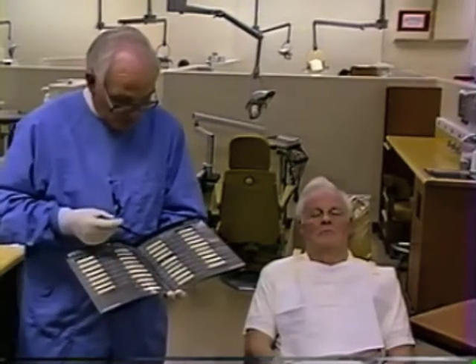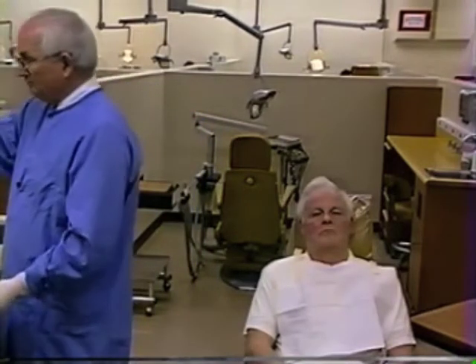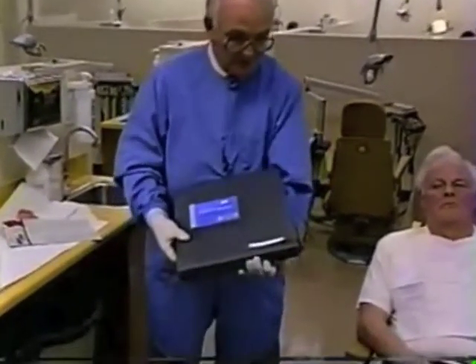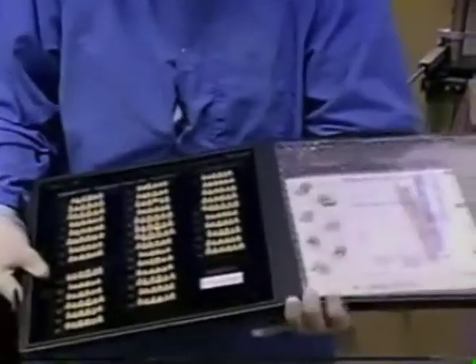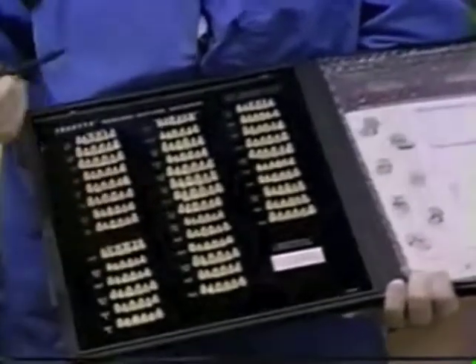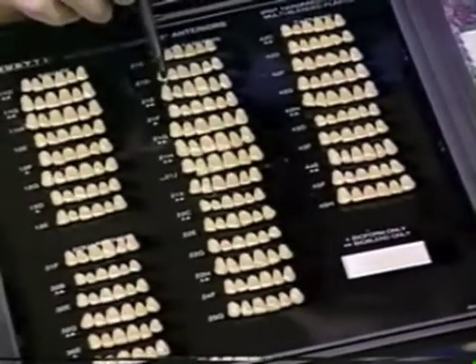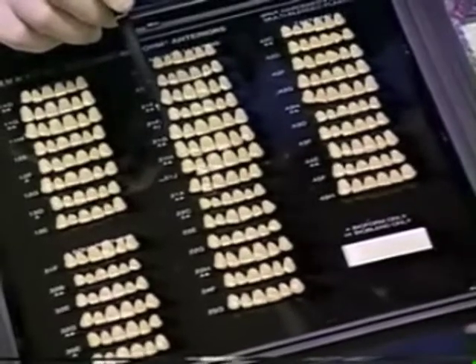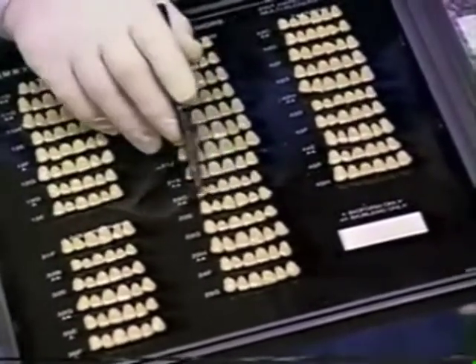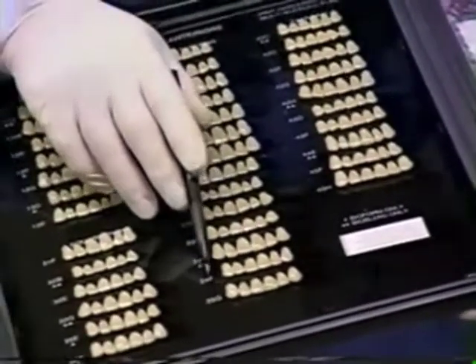Now we want to look at some of these molds, which we can find on our mold board. This is the mold board as it comes from the manufacturer — all the teeth have samples here. In the square tapering range, we have these teeth from the manufacturer, and we want to find the one that fits best for our patient. According to the dimensions, 22E was one that would work — which is this tooth here.